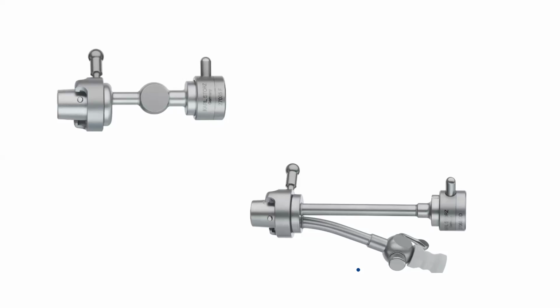You are missing something, no? Look at the length of both the bridges. Short, and this is a long one. Why is there a long bridge? Where is it used?